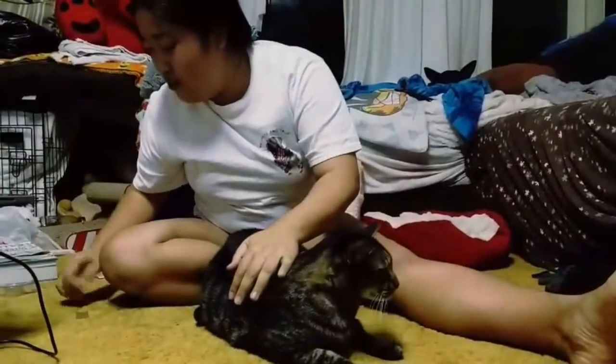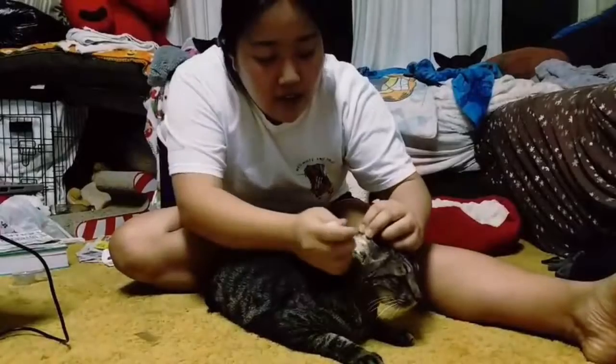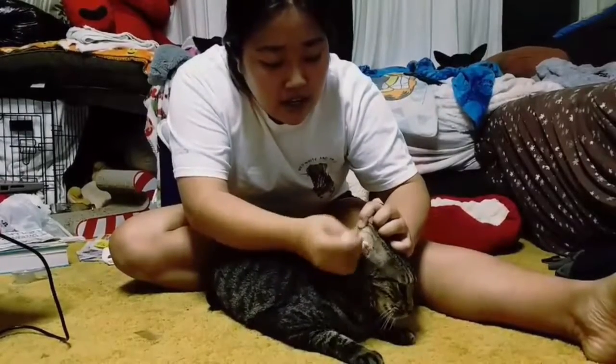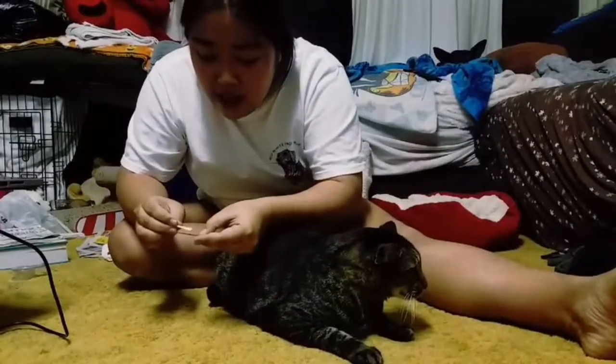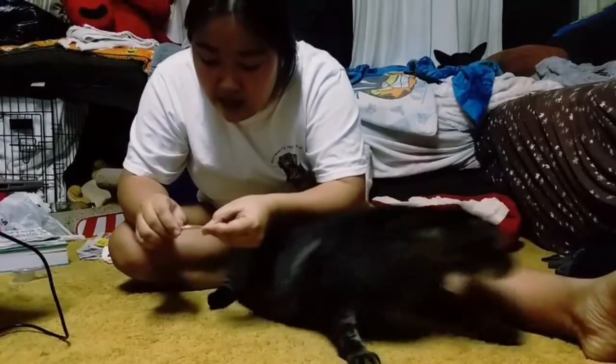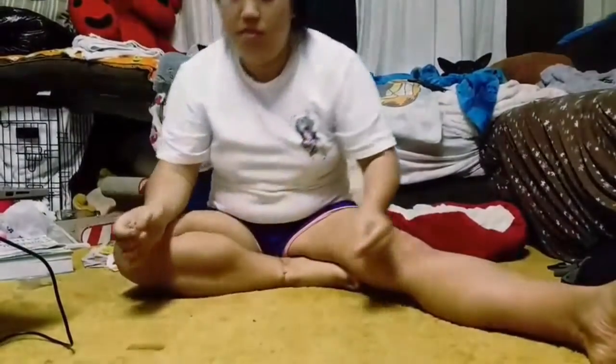Okay, so to do an ear mite check, you're going to swab their ear. Oh, your ears are so gross. And then you're going to put it on your slide, put a little oil on it, and look under the microscope with that.